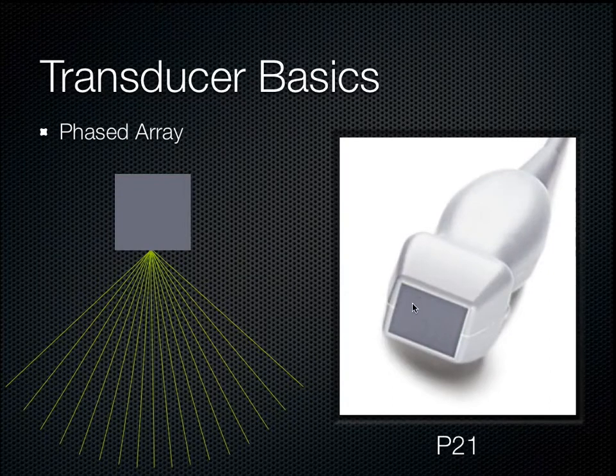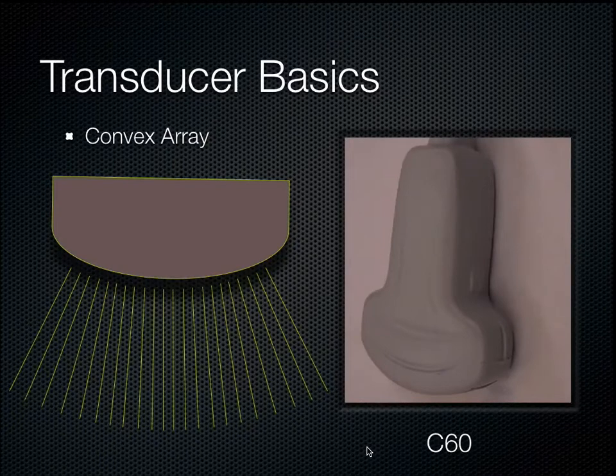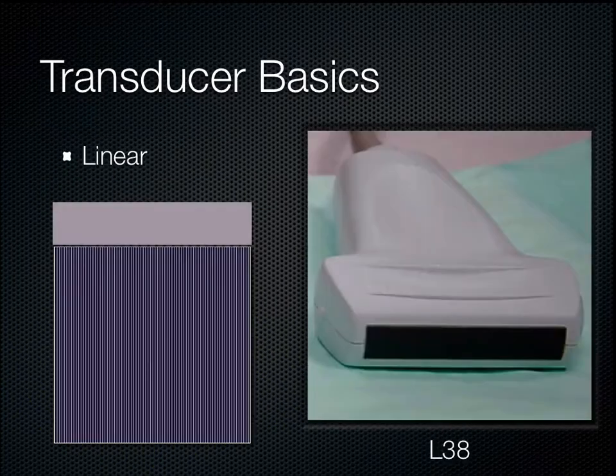This transducer is really designed for the heart, though sometimes it is used in the abdomen. You can get away with it in the abdomen for really obvious structures like a late first trimester, second and third trimester of pregnancy. You can certainly get some basic information there. And as I mentioned, going between the ribs, you can see the liver and therefore the gallbladder with that probe. You can get away with it, but in the abdomen, you're going to get much prettier pictures anywhere subcostally using this C60 transducer. Now, what about the linear probe?